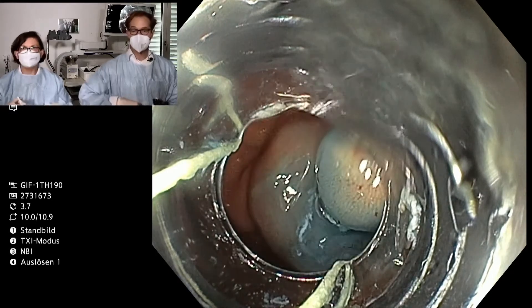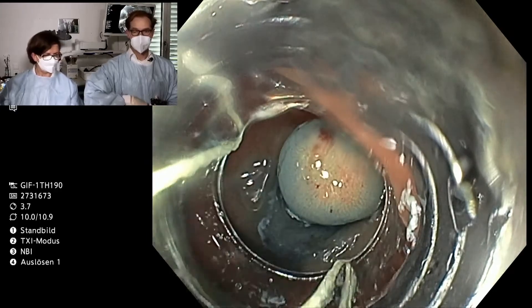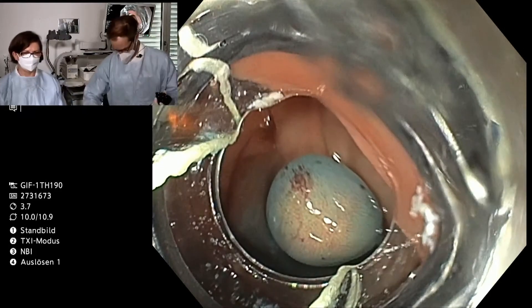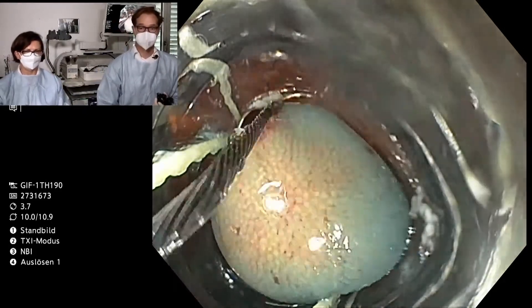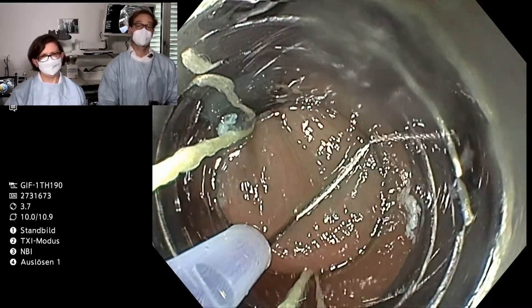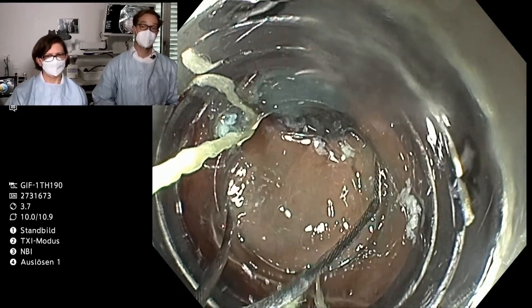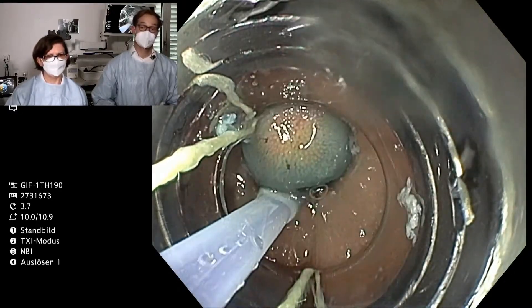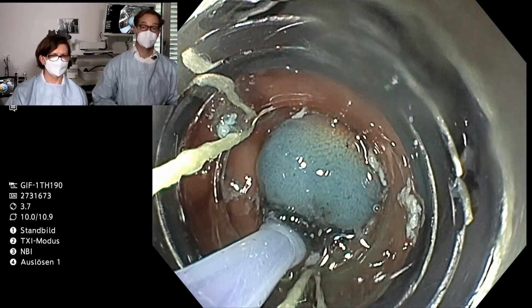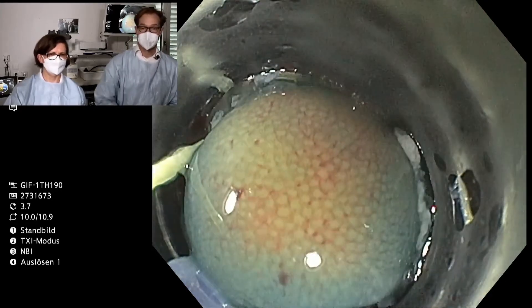Through the cranking device I can now also insert the snare, and I will try to cut below the ring, close to the colon wall. I open the snare, I can see the ring now, and I close slowly. I am below the lesion — I can check once again by lifting the endoscope tip. It looks nice. Now I cut the lesion and suck it out.